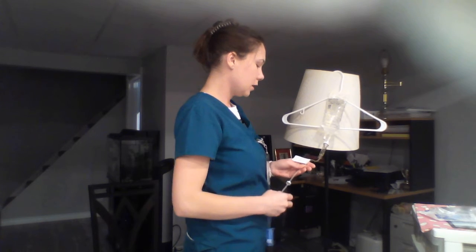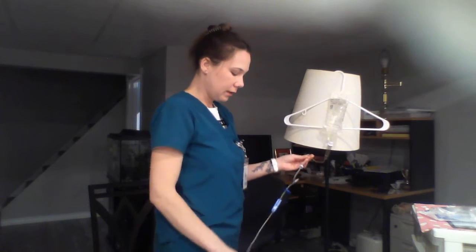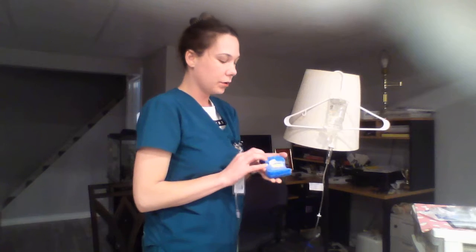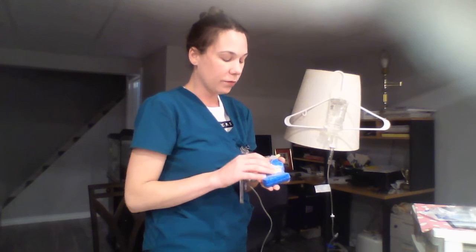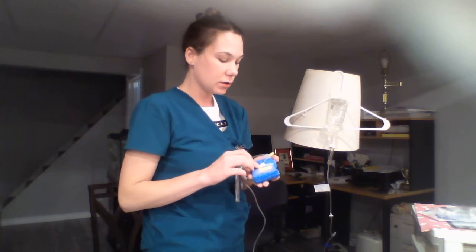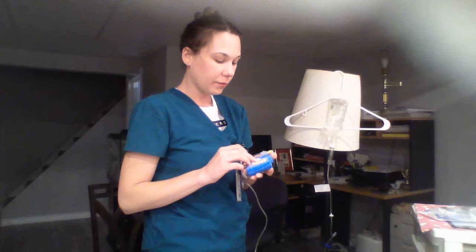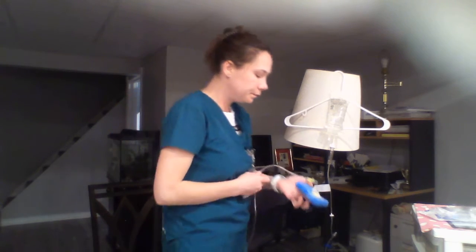So this was put in today at 0600. There's no kinks in the line. And I also want to assess the site for any infiltration or phlebitis or just any adverse reactions to the medication. This is also dated for today. This was put in this morning.